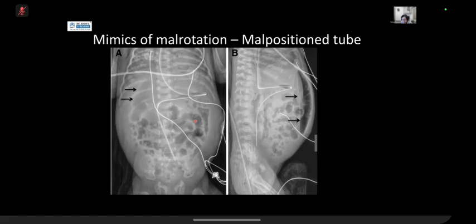So in my practice, what I often do is an upper GI contrast study. If it's abnormal, showing a malrotation, I often just put an ultrasound probe on to have a look as well. Okay, but everyone's a bit different, so yeah. Okay, we're going to lower GI. Any questions you can write in the chat, and I will answer them during the break.